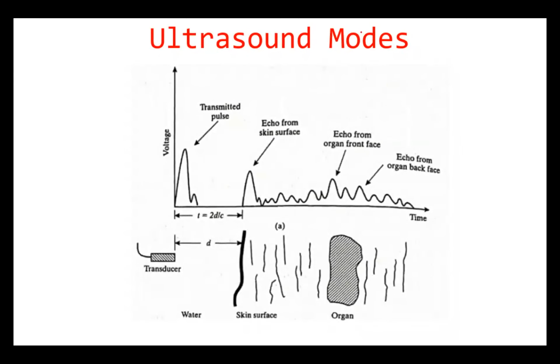So ultrasound modes, actually, I have a transducer here. For example, you take this organ as kidney. So in between the kidney and the transducer, I have some extracellular fluid here, water molecules. I have a dermis layer, skin surface, and I have some muscles.